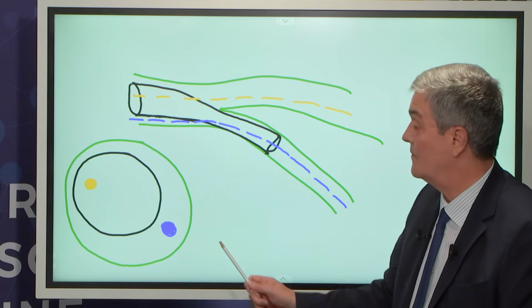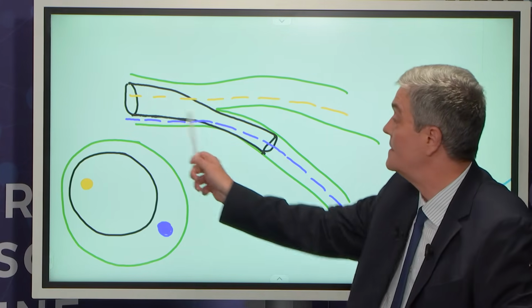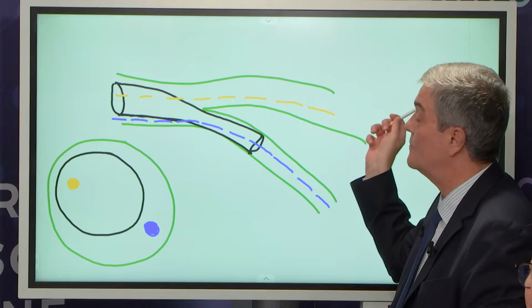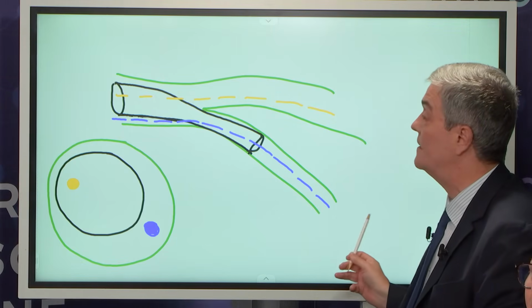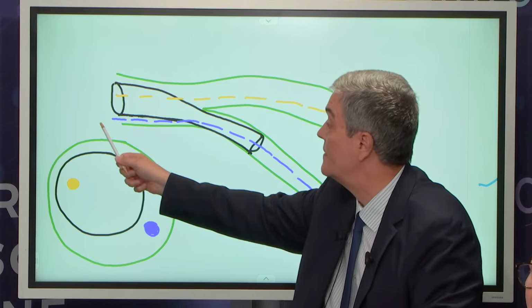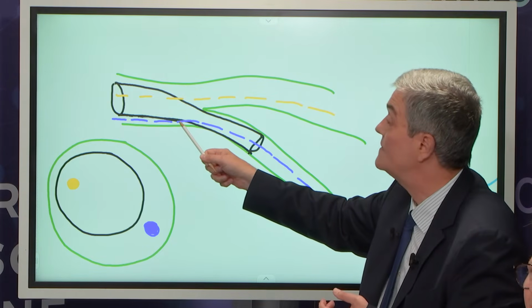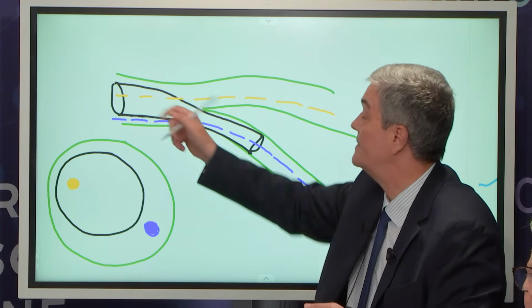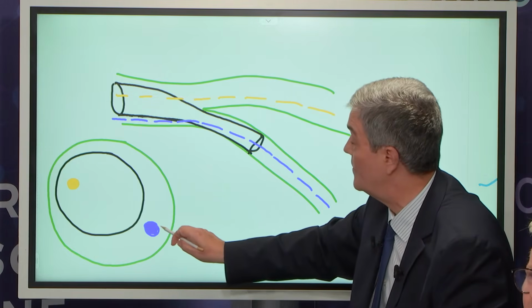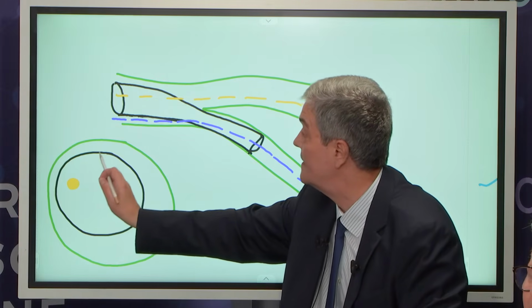So they didn't do POT. And after deploying the stent from the left main into the circumflex, they simply pulled back the wire that was inside the stent and then went with that wire in the LAD, pulled back the wire from the LAD that was jailed, and reinserted it in the circ. Reinsertion of the LAD wire was actually, according to this IVUS imaging, abluminal, outside of the underexpanded stent inside the left main. If you see this cross section, this is a wire that goes into the circ abluminal, and this is the wire that goes through the stent into the LAD.